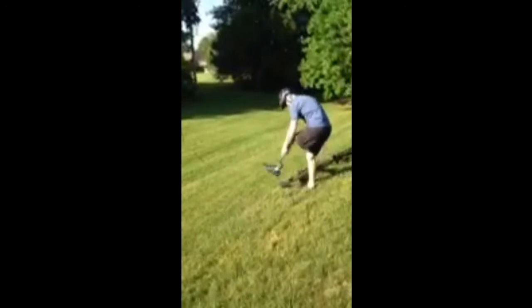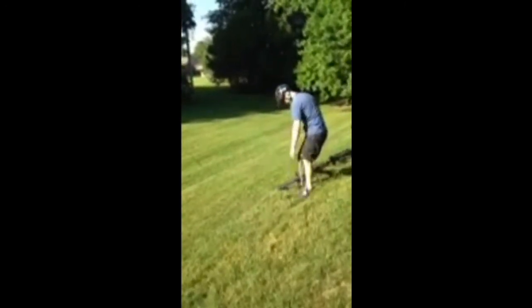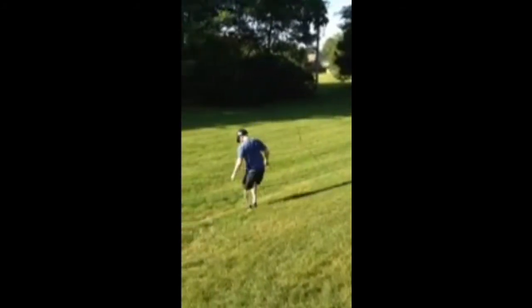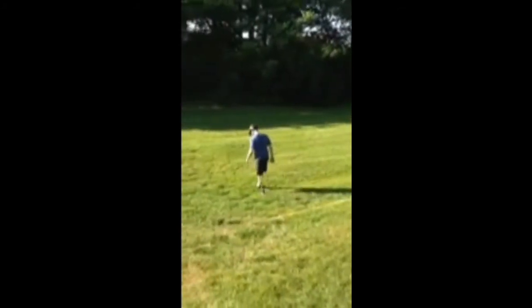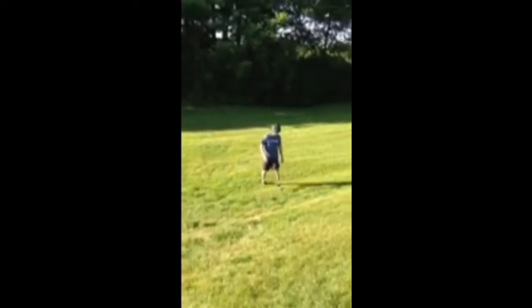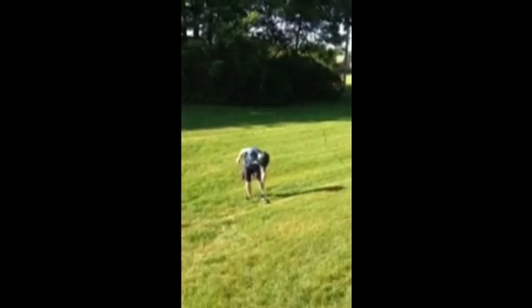Stumble recovery is really important because, as you see in this video, you don't always remember that you're in free swing. You get off a bicycle, and now you have an issue. So this person is walking down the hill using stumble recovery to keep him from falling.